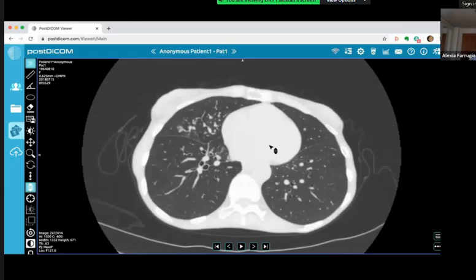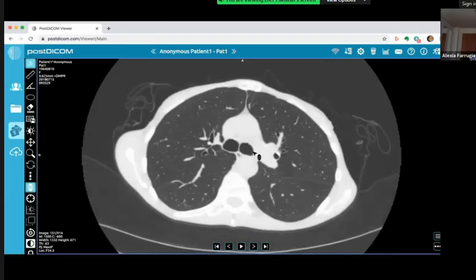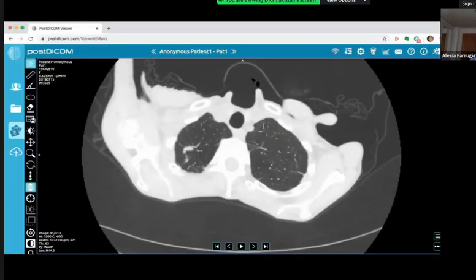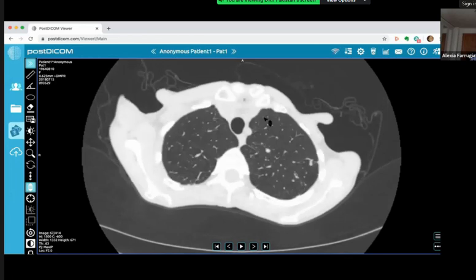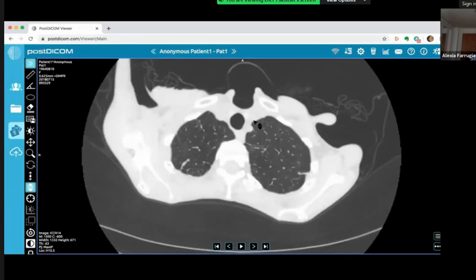So is the lung mass in the apex a separate pathology, a cancer? That we are following up. Okay. Because of her history of COPD and because of the appearance, it's rather spiculated. So she's being worked up for that.